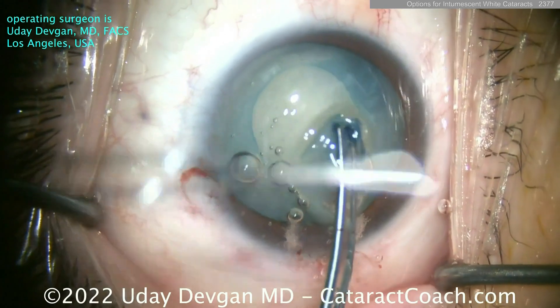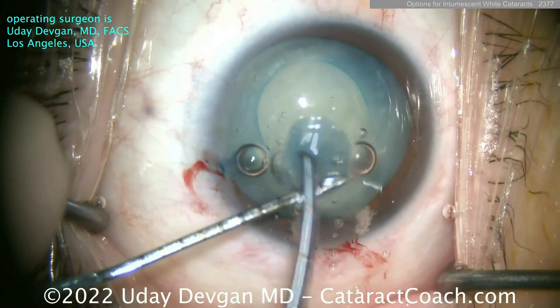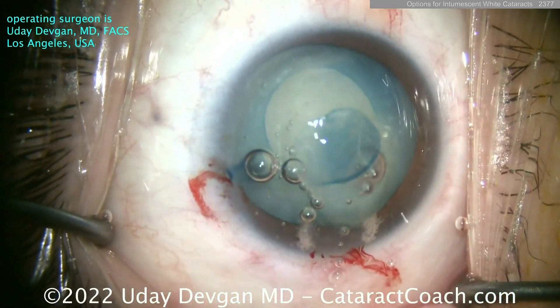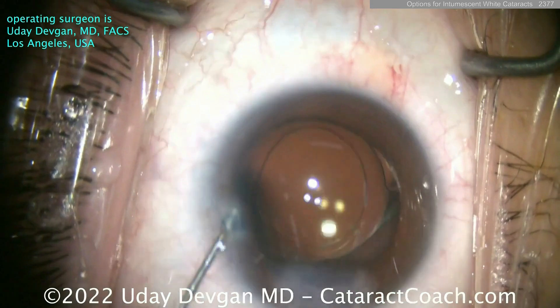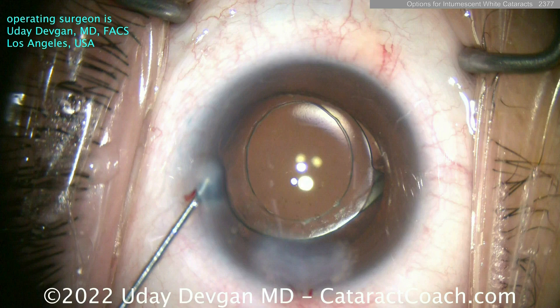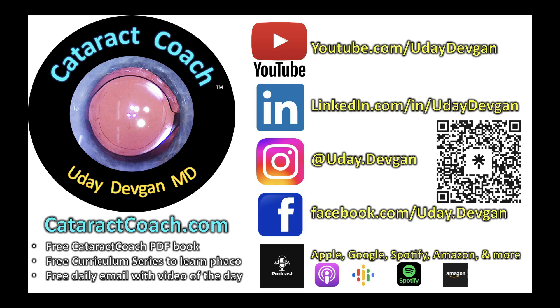And it's perfectly round, it's strong, and there's no risk of capsule runout. So all these are very reasonable choices. If you have an intumescent white cataract coming up, do something special like we showed you here to avoid capsule runout and have a safe case. Remember, check out our podcast — the top podcast in all of ophthalmology. You will become a better surgeon just by listening to it.